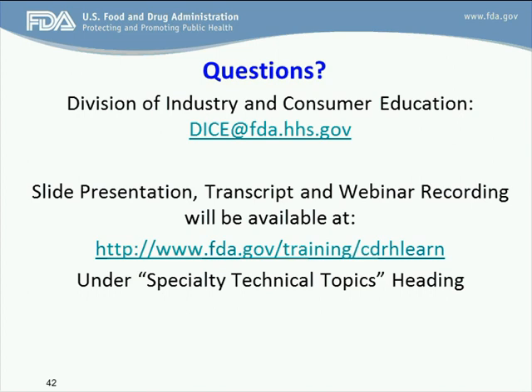Our first question is from Pentos Medical. Your line is open. Great, thank you. We really appreciate FDA's guidance regarding reprocessing. This is obviously a challenge for a lot of companies, and we appreciate the opportunity to talk directly to you about the guidance document. One thing that FDA noted in the guidance was that all relevant internal surface areas should be sampled during the extraction method, and in some cases, additional disassembly processes may be required to adequately extract residual soil. So what we're wondering is if FDA could describe its expectations specifically regarding side viewing duodenoscopes, and whether or not the expectation is different for these scopes compared to other endoscopes.